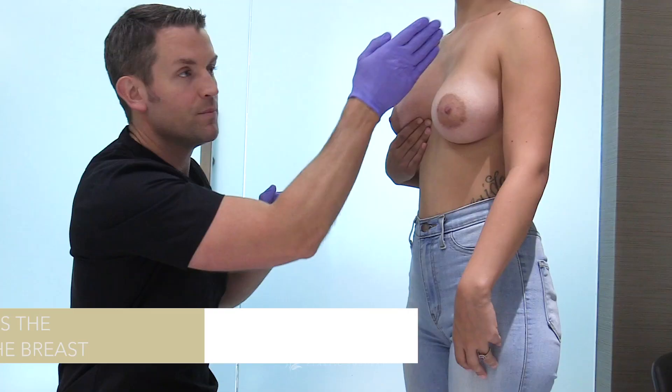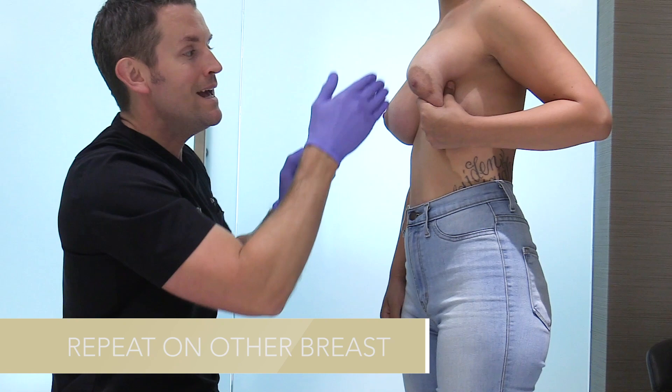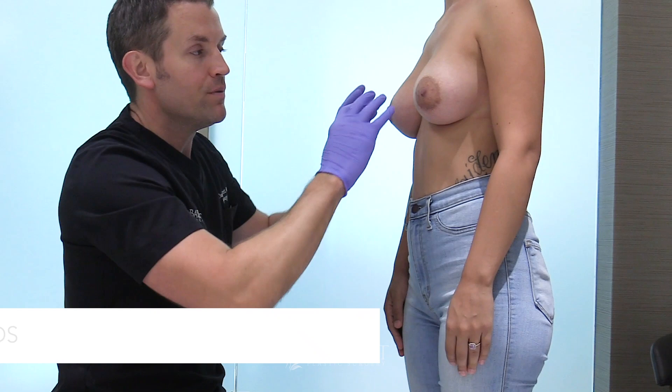It rises up in the direction of that shoulder. We're going to do the same thing on this side — push that, and aim it a little bit more towards the other shoulder. That helps develop the cleavage more in the middle. What you don't want to do is massage outwards, because the implants will tend to fall out in that direction. We want to keep it up and to the middle.